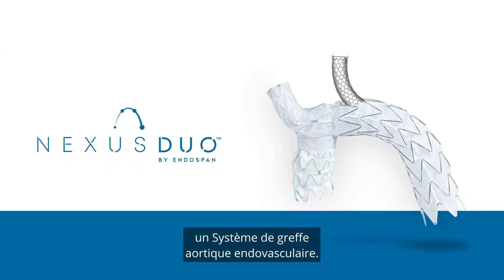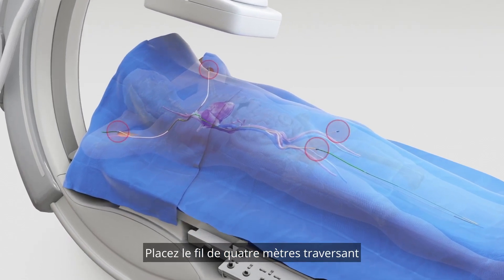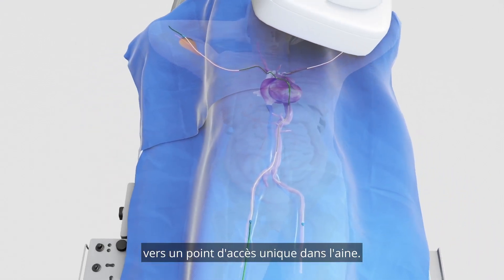The Nexus Duo endovascular aortic arch graft system. Position in place the through and through 4mm wire from the right arm and the through and through catheter from the left arm to a single point access in the groin.